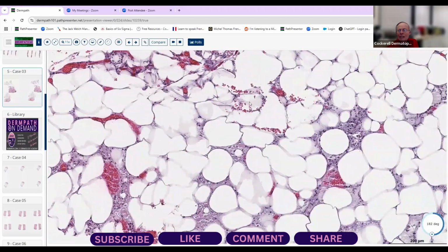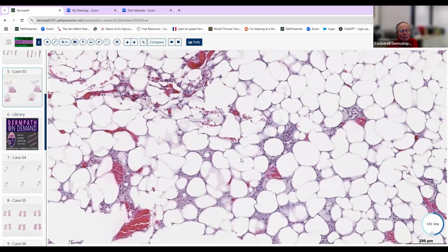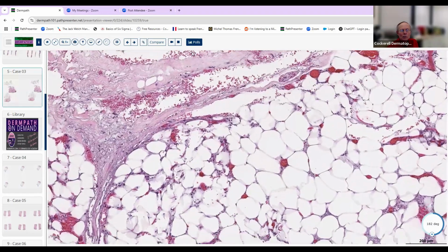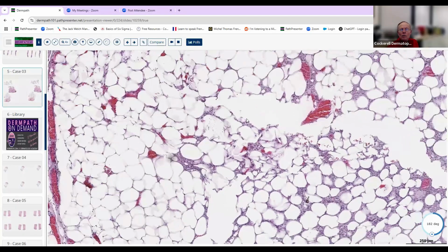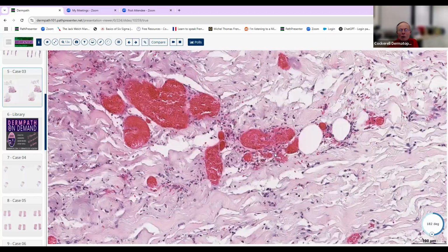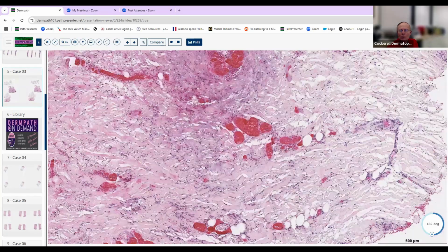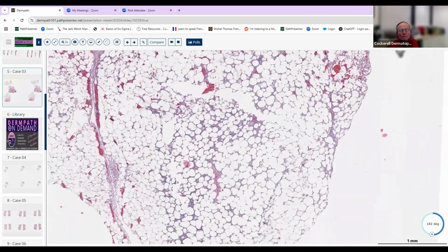And let's look down in the subcutaneous fat. Now you do see some of these smaller blood vessels, and there's some fibrin in these small capillaries down in the fat. So this is a thrombotic process. And it's not just getting one or two blood vessels, it's really getting a shower of small blood vessels, with fat necrosis and also necrosis of the sweat glands and necrosis of the epidermis. So this is some type of thrombotic vasculopathic process. There's some sludged red cells, but you see some fibrin in some of those cells as well up there superficially. So we're not sure what's the cause of this in this situation.